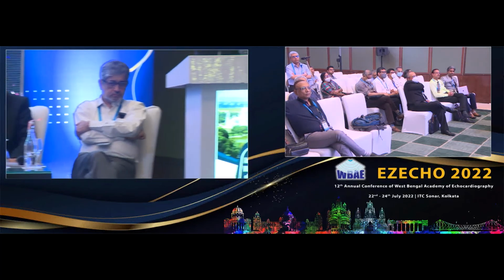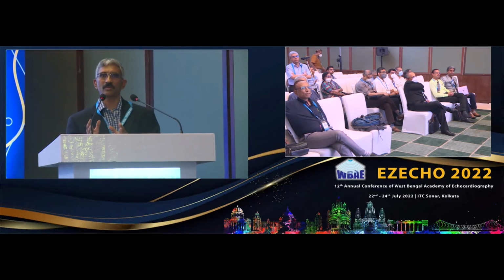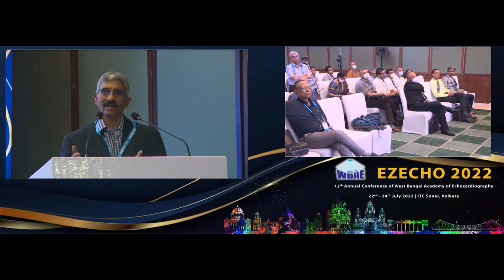We use the American College of Cardiology 17-segment model, and we describe it within the 17 segments to tell you exactly how much scar burden there is. But if you think about the fact that you're trying to decide whether it's transmural or less than 50%, again, I'm talking about the ischemia viability category. I think Dr. Berkeley will speak more about cardiomyopathies, where it might be a little different in terms of how you approach it. But in the ischemia viability category, if you're trying to decide whether it's less than 50% or more than 50%, and in which territory it is involved, you're actually very accurate, I would say, by just doing the visual quantification.